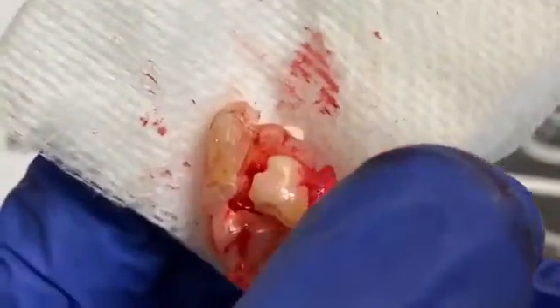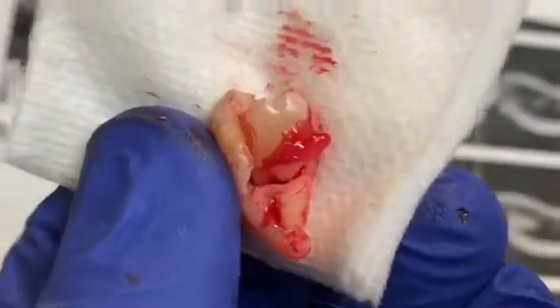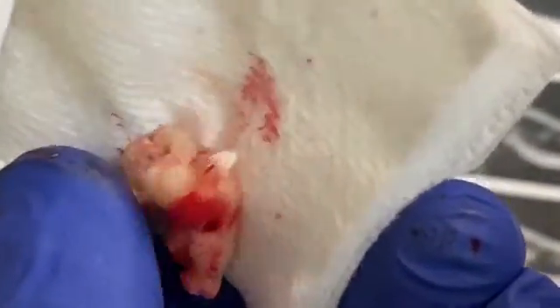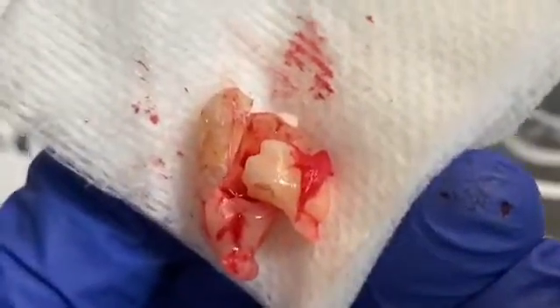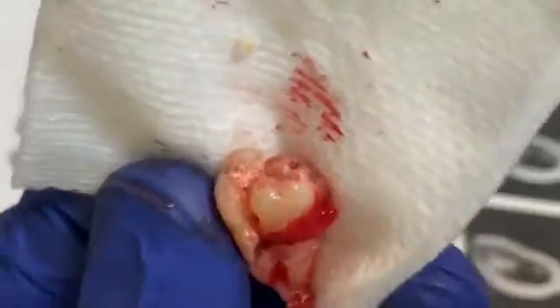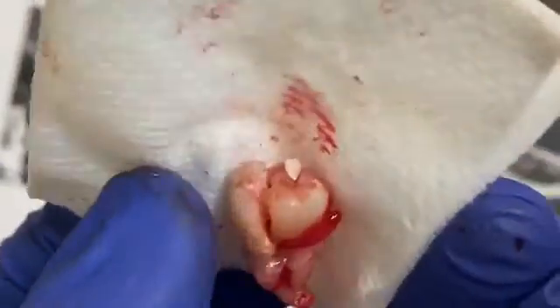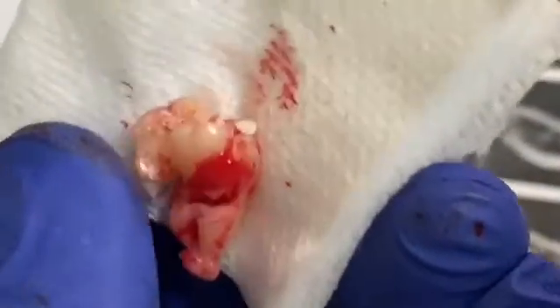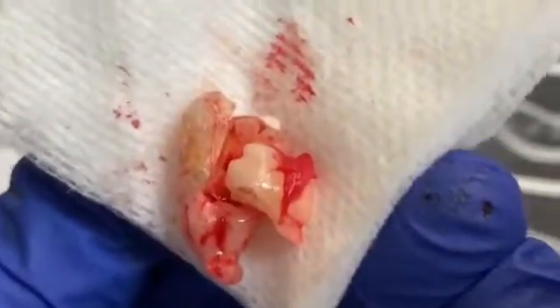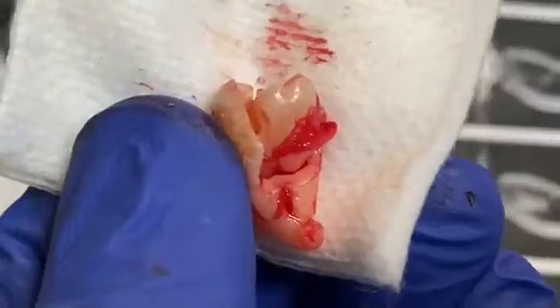The root is really curved. It took me about 10 to 15 minutes, but it wasn't that bad. The patient was 22 years old — Asian American — so the bone wasn't that hard. Just needed some levers to luxate the tooth, and it should come right out after you flap the case.